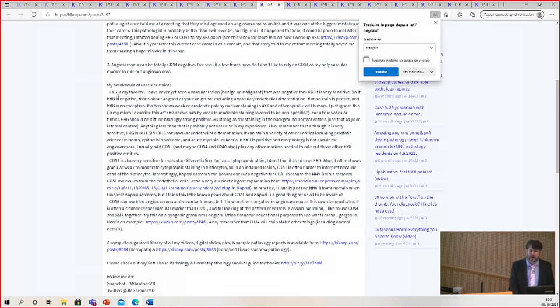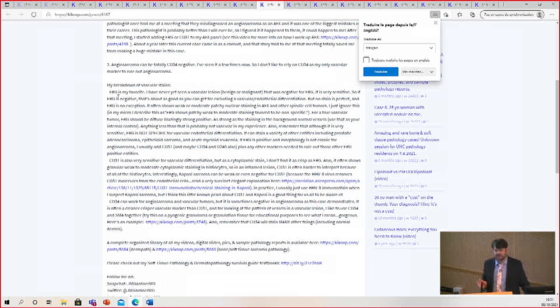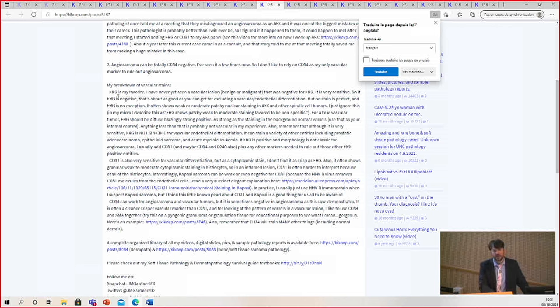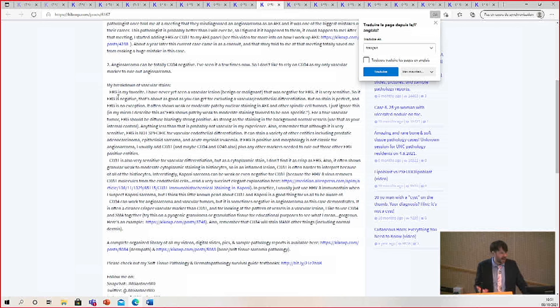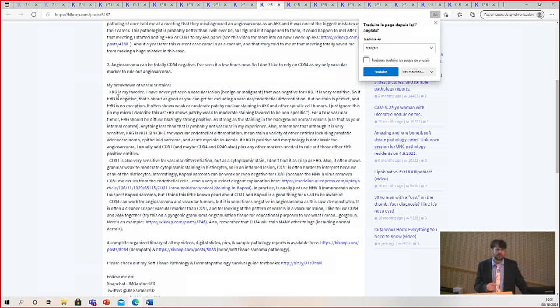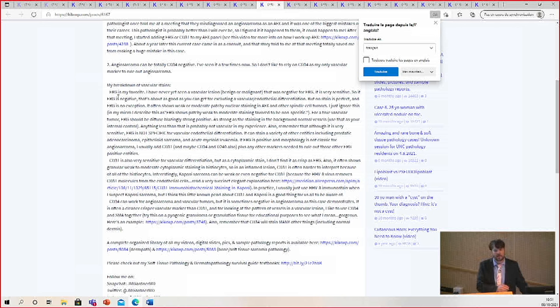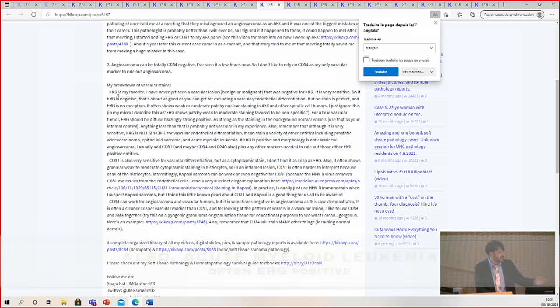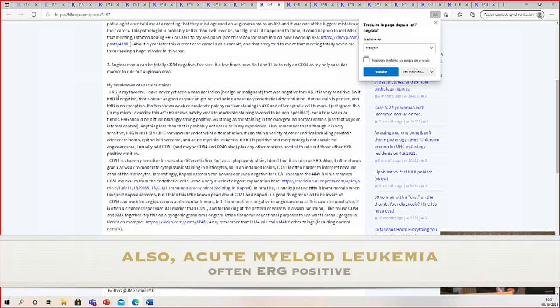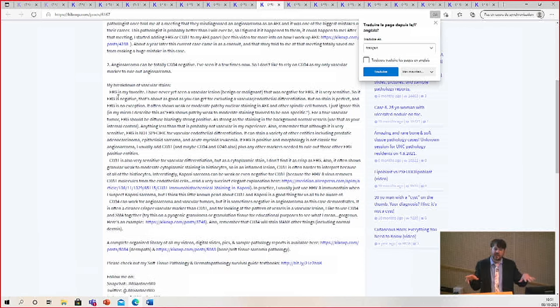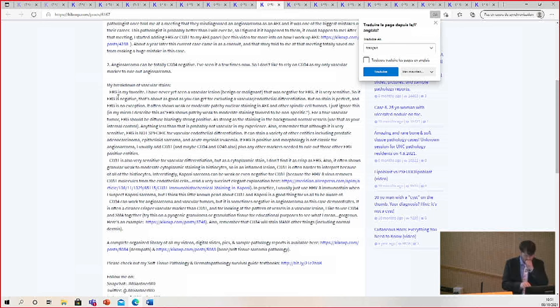So ERG is very sensitive. I have not yet, knocking on wood, not yet seen an ERG-negative vascular tumor. I'm sure I will eventually, but I've not encountered one yet. But it's not specific. ERG stains lots of things - it can stain prostate cancer, epithelioid sarcoma, that new spindle cell thing EWSR1-SMAD3. And sometimes AFX will have patchy staining, not diffuse strong, but patchy weak to moderate ERG staining.